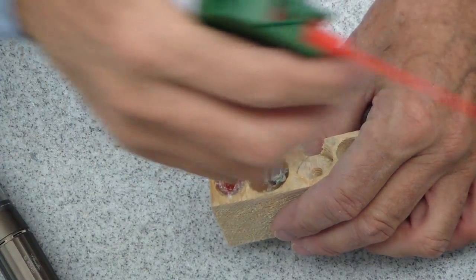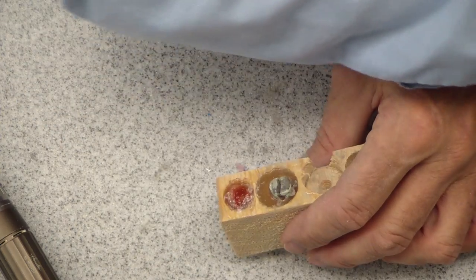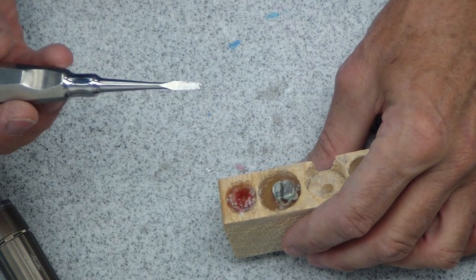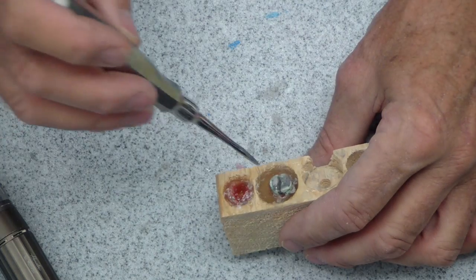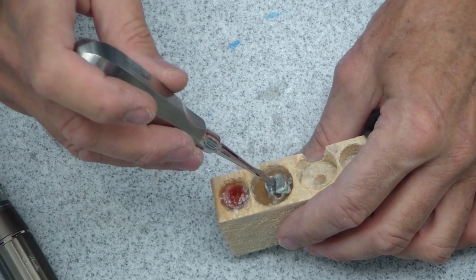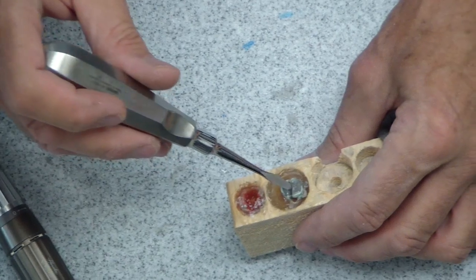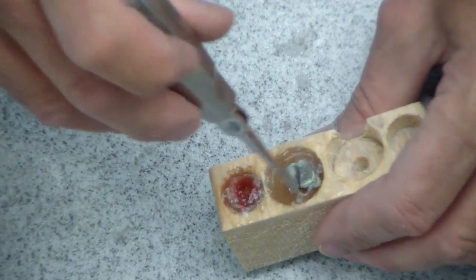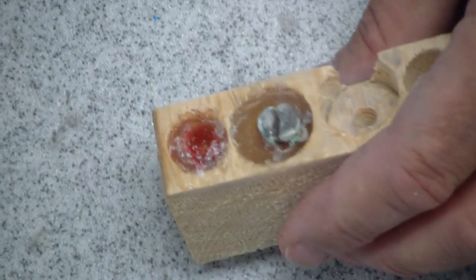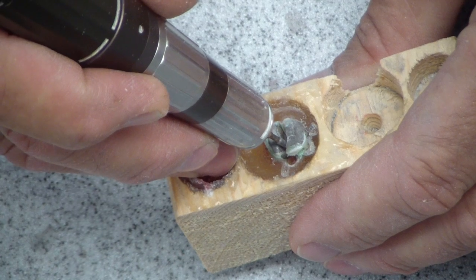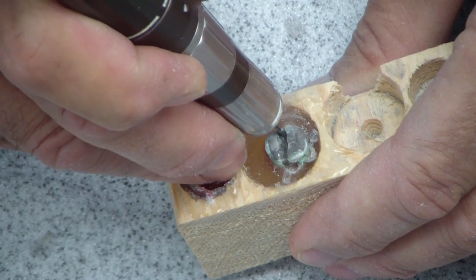From my previous lectures, I like to make the slots wedge-shaped because the Cogswell A is wedge-shaped. And so I slide it in there and I can twist it in there and I can get it in there a lot deeper. If it only goes into the top, when you twist it, all you're going to do is chip off the top part of enamel. You want to get it all the way to the floor of the pulp chamber before it starts to bind. That's where you let the pressure lead.